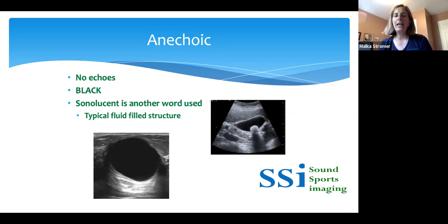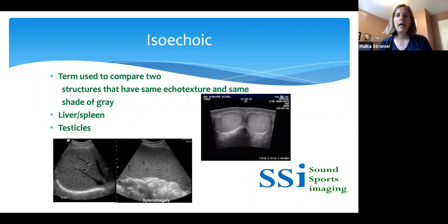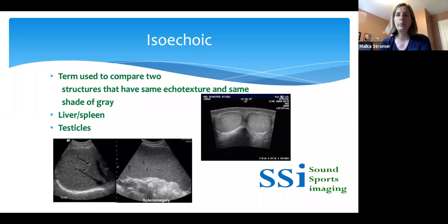Anechoic, as we recall, is lacking echoes, and therefore it is most commonly associated with something that is fluid-filled. We can see here with the cyst and the gallbladder that these are anechoic structures and they appear black on ultrasound. Isoechoic structures have the same echogenicity next to one another. Here's an example of two testicles within the scrotal sac — they both have the same echogenicity. We can also compare the liver and spleen, which often have very similar echogenicity and are isoechoic. Using a dual image, you can see both look quite similar — they're isoechoic.